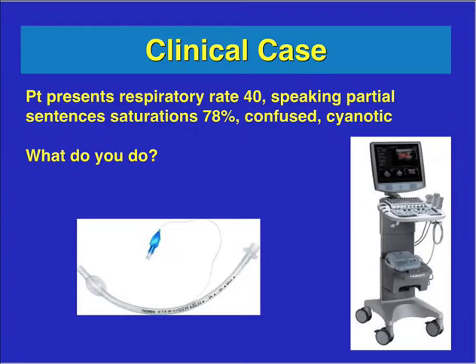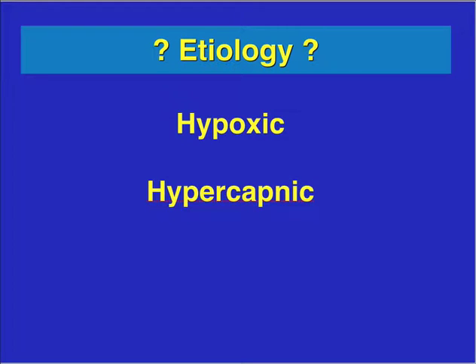Also, I use it when I've had to endotracheally intubate someone for respiratory failure. After I get the patient stabilized and oxygenation improved, I immediately do the ultrasound. So remember, most of our etiologies are hypoxic and hypercapnic, and so our ultrasounds are focused to evaluate those.